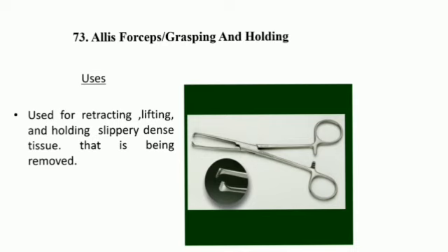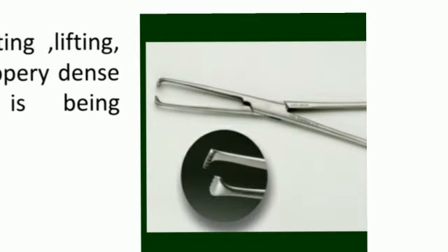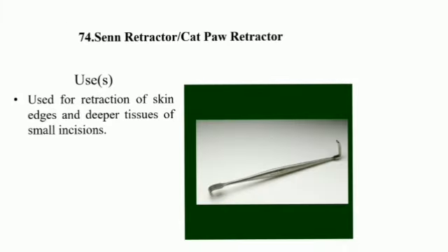Senn Retractor, also called Cat Paw Retractor: used for retracting the skin edge and deeper tissue of a small incision.